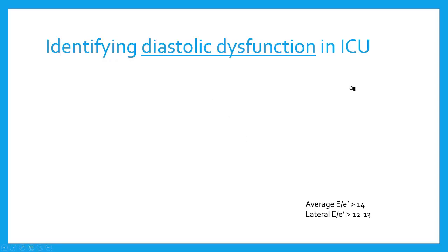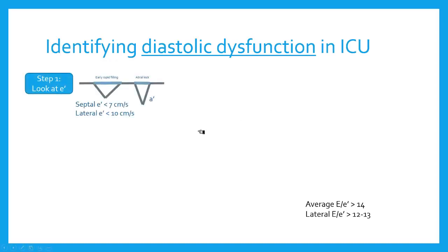Identifying diastolic dysfunction in the ICU is actually very simple. If you remember from the last lecture, there is one marker that we can always start with because that's our most sensitive and specific marker of diastolic dysfunction, and that is our E-prime velocity. So let's just start by looking at E-prime.